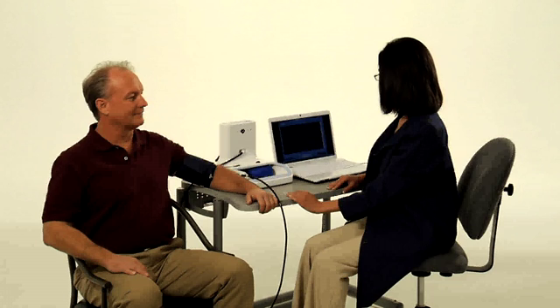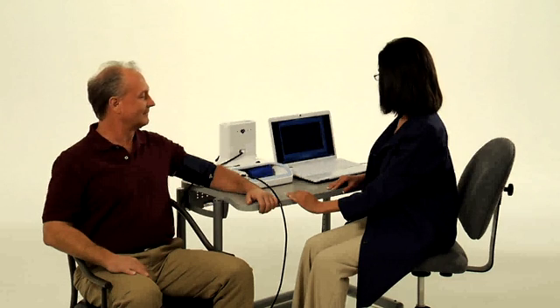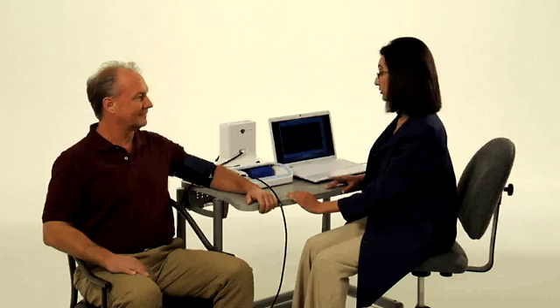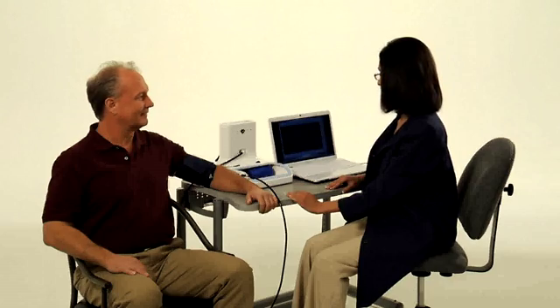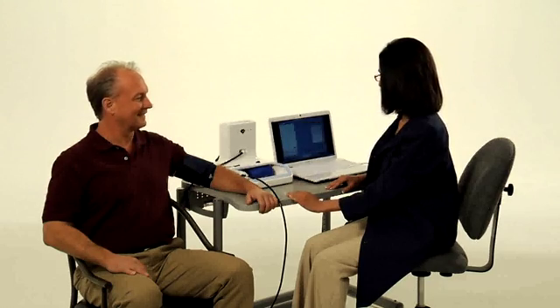During inflation and deflation of the cuff, it is very important that the patient's arm remain still, so that blood pressure is measured correctly.